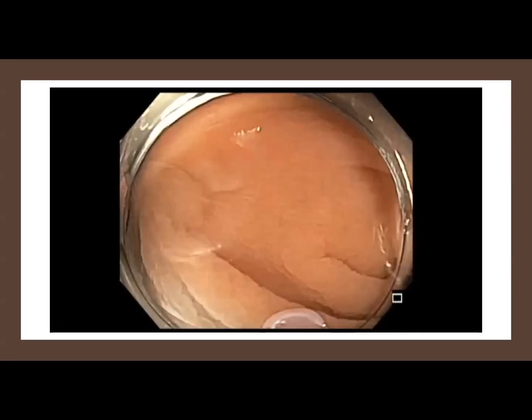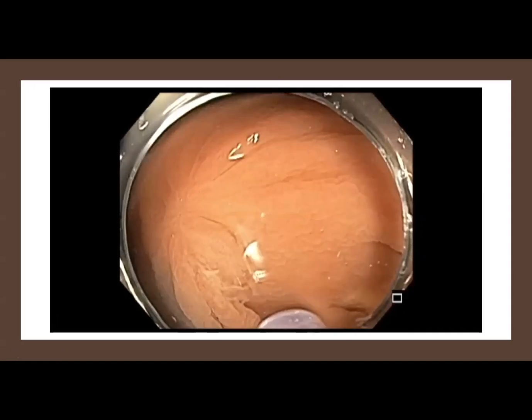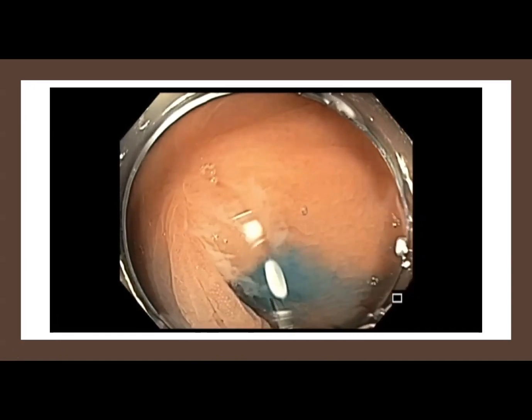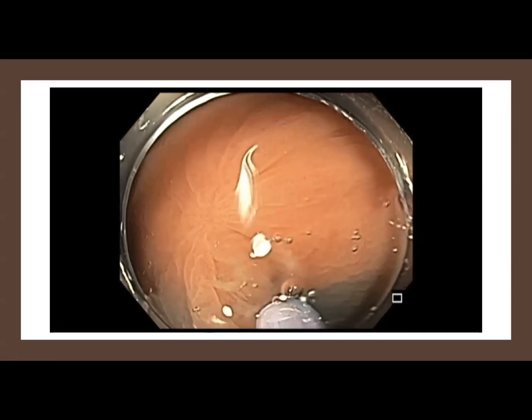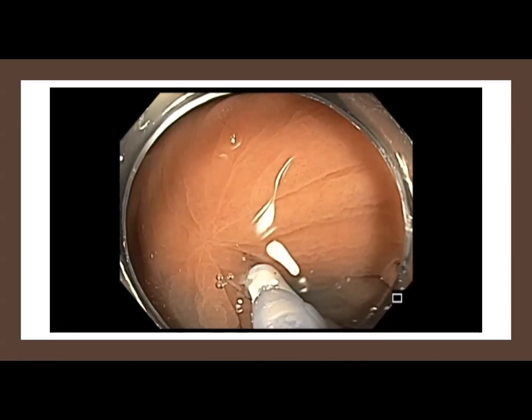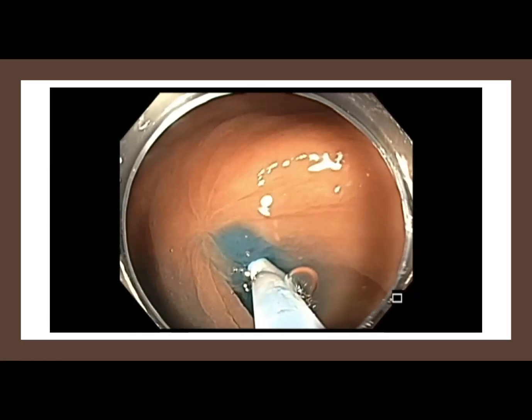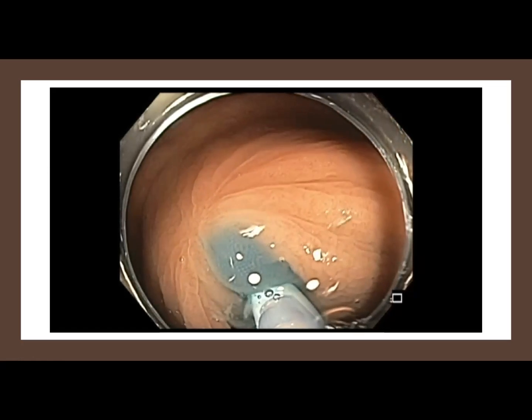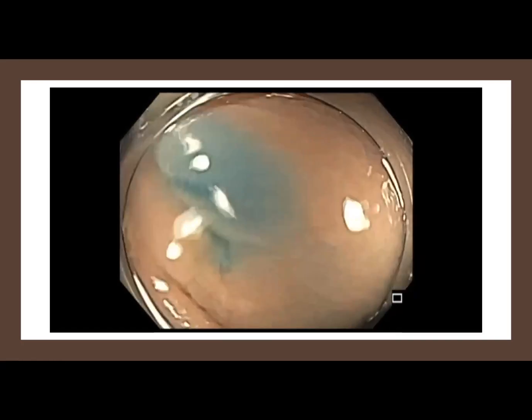And one comment I want to make is when the endoscopist outside tried to do the resection, he did mention that he had a very difficult scope insertion to the cecum, and he used just a hot snare for resection, and he was not able to see the second lesion between the IC valve and the floor of the cecum. And one thing is injection of these lesions with prior cut are not easy.